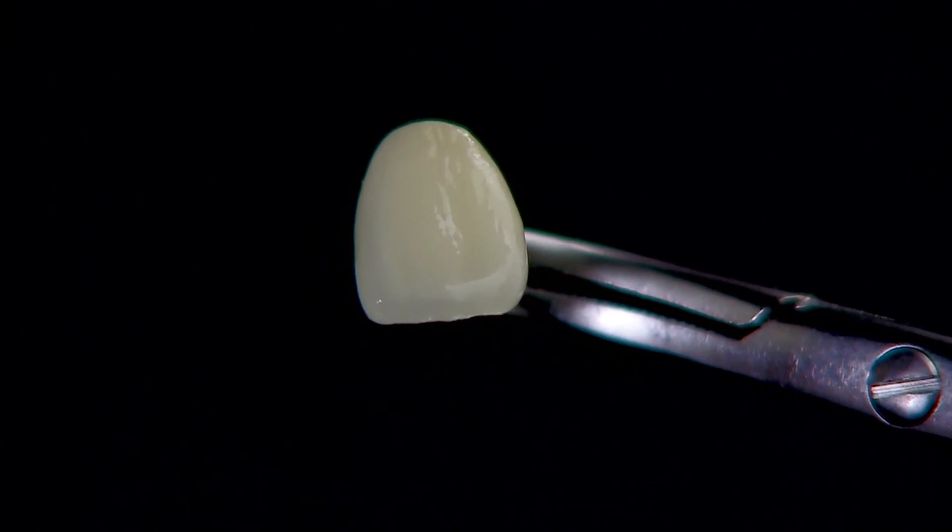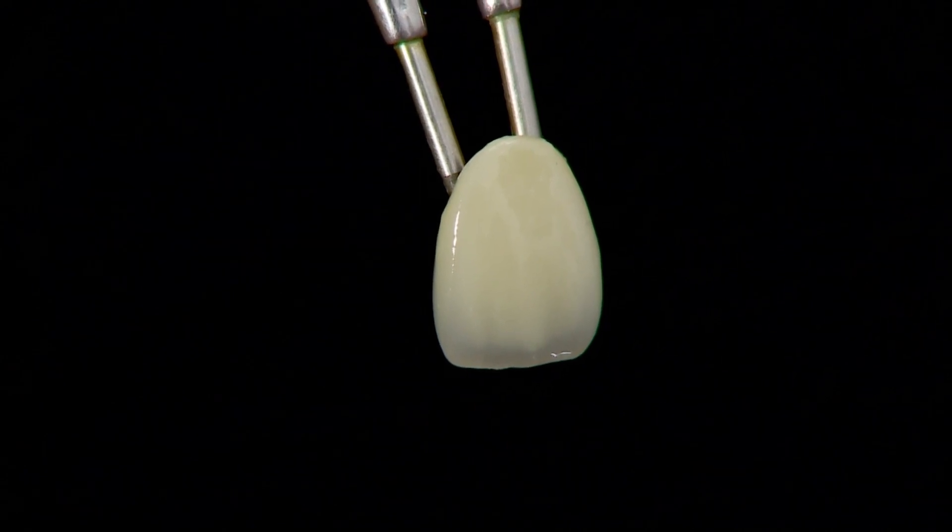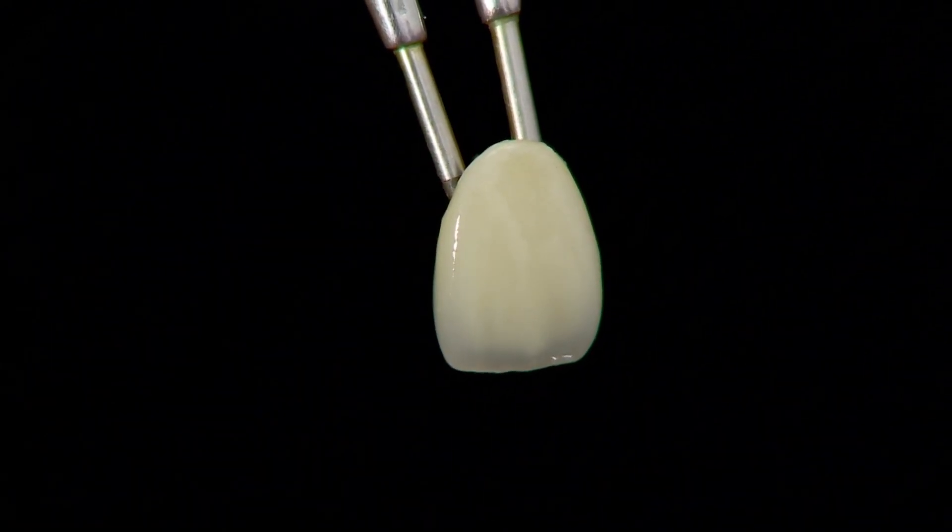Notice the natural gloss and translucency at the incisal edge of the completed crown.